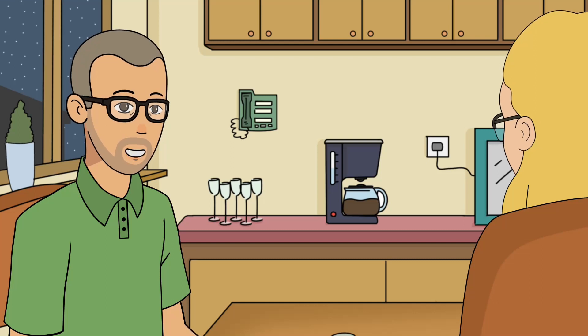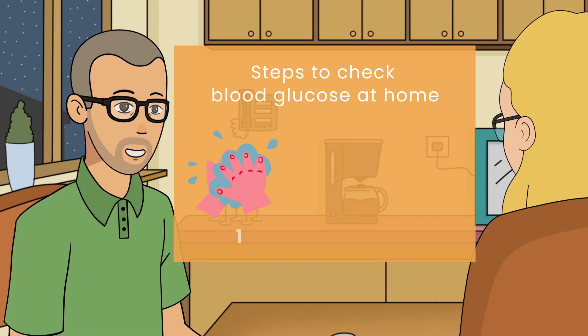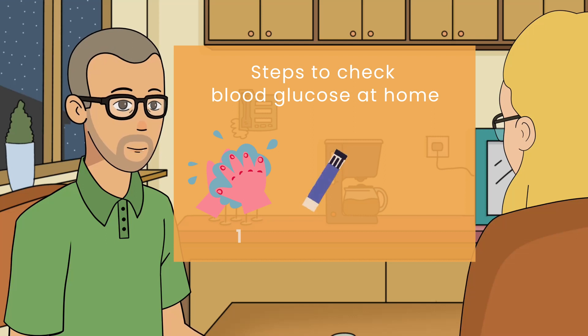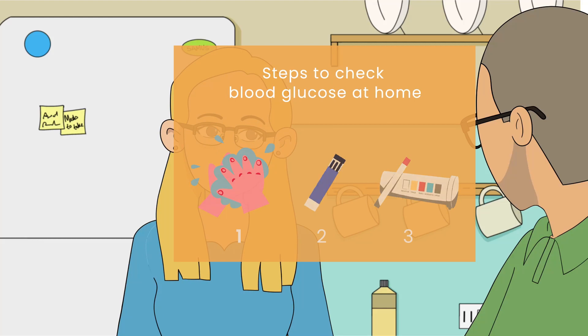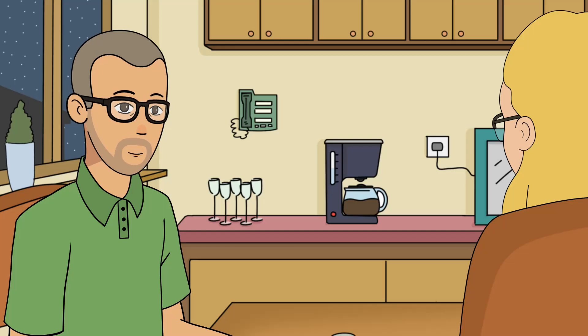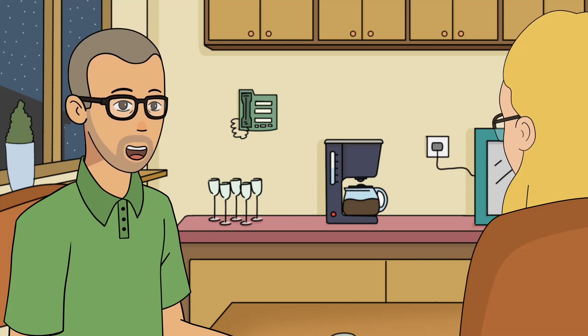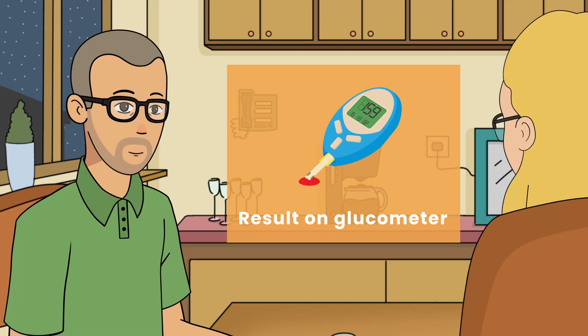So first you wash your hands with soap and water. Remember to always use a fresh lancet. Then place a glucose test strip on the glucometer. You need to use a new test strip each time. Make sure the code on the strip matches the code on the meter. Then you squeeze from the finger's base and carefully place a drop of blood onto the test strip. In a few minutes, the test results will be displayed.